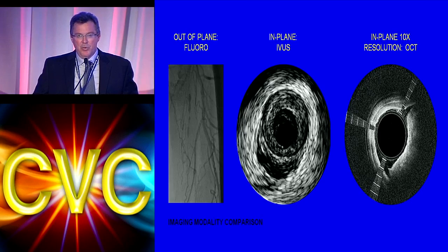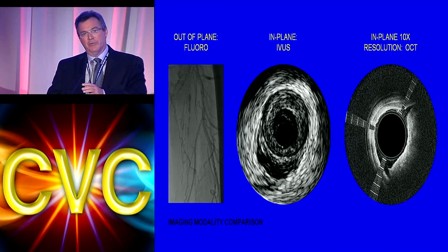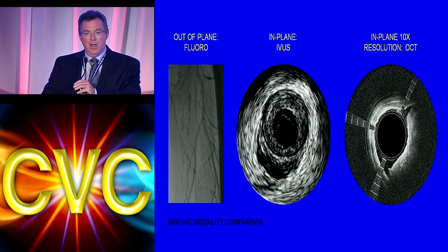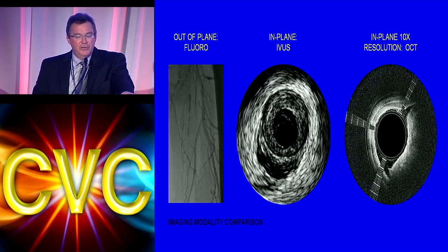So the different types of modalities that we have to image these right now in real time, at least when we're in the lab, are fluoroscopy, which is out of plane. As you can see, we have a total occlusion. We don't see the vessel itself.